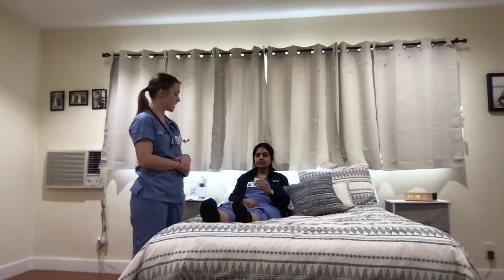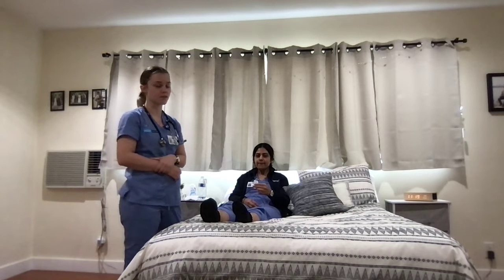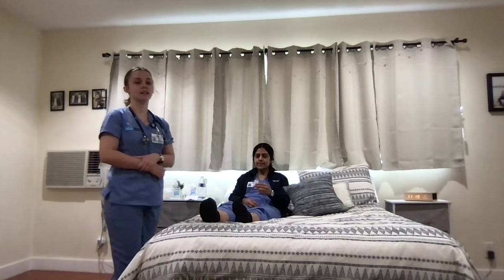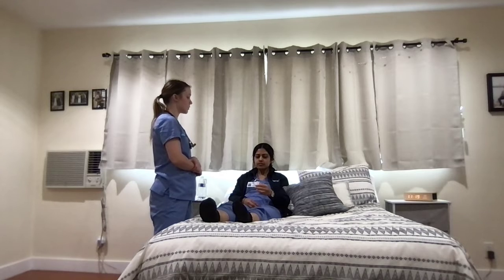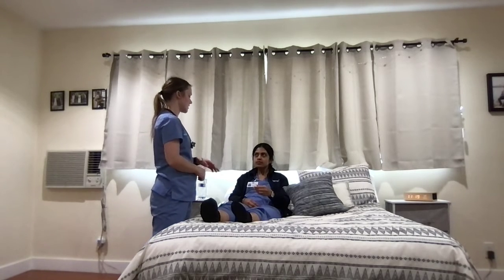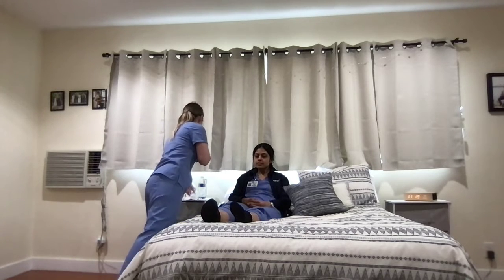Okay, as the patient is return demonstrating, I'm going to observe to make sure that they are using it properly, they're reaching the specific volume given, and that they're able to do the frequency. So you're going to do this 10 times every hour in this post-op period. Do you have any questions? Okay, you can take that. We're done with this one.